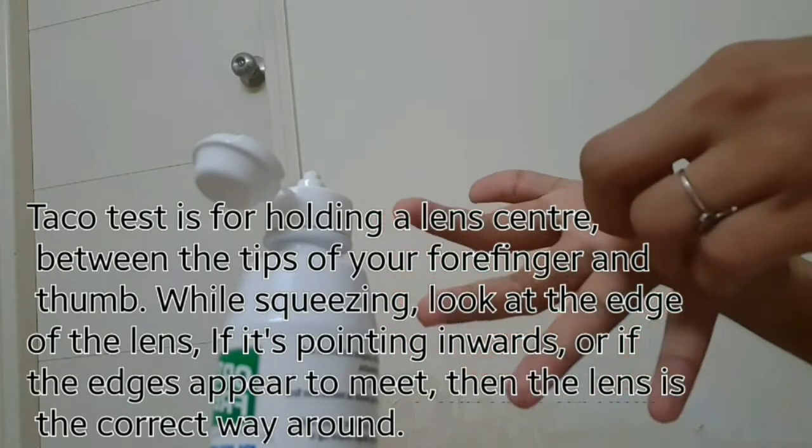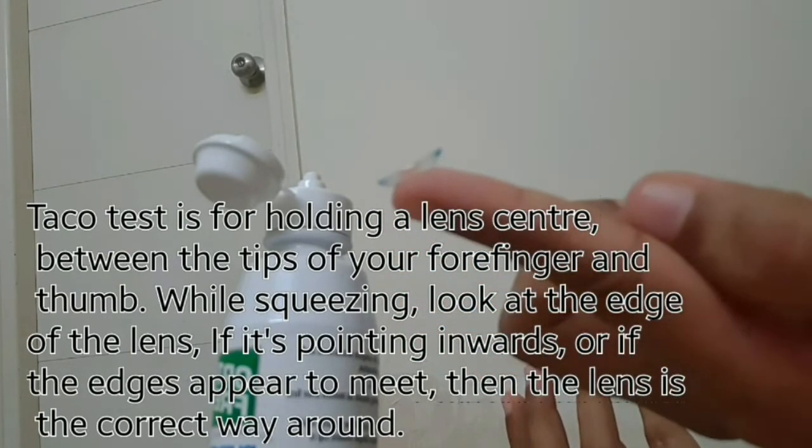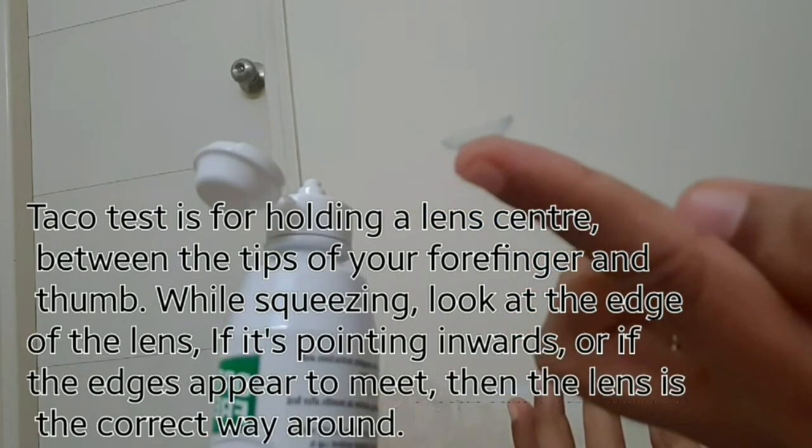Place your contact lens on top of your index finger. Make sure your contact lens looks like a bowl shape, where the edges look inward — this is the correct position.